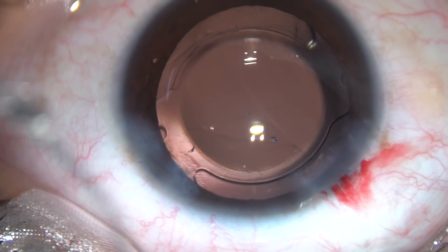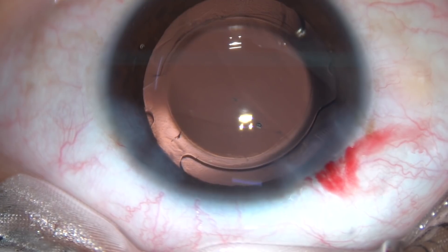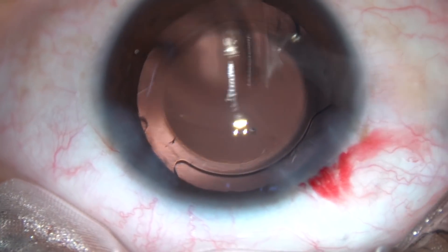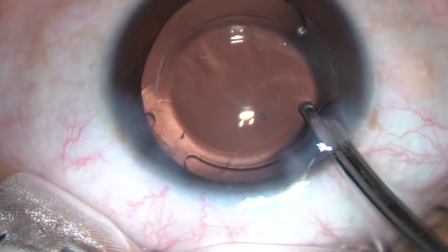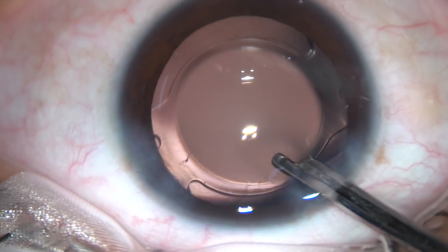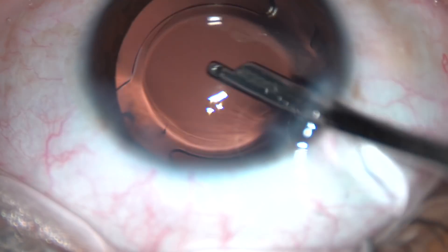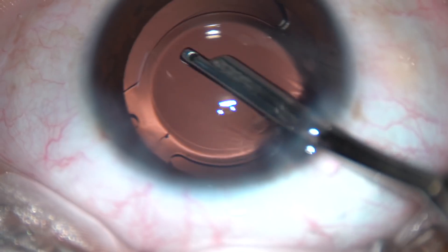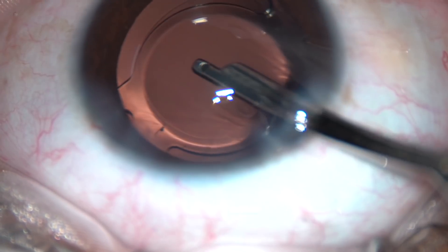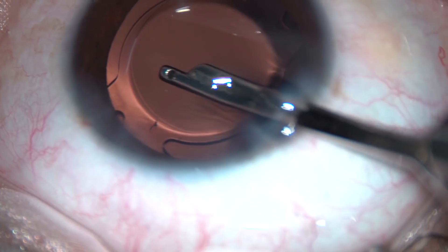The single side port is now hydrated. A final lavage is done — this is an unedited video and you have watched each and every step of the surgery. During this final lavage, whatever viscoelastic substance sticks to the corneal endothelium is washed out. The anterior chamber is formed nicely and the case is concluded.